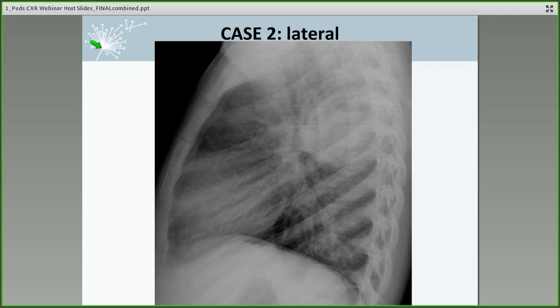So we concluded that this was much more likely to be staph or strep disease, and we're going to watch her over time without TB treatment. So I thought that was kind of funny and fun, and that was just this winter.